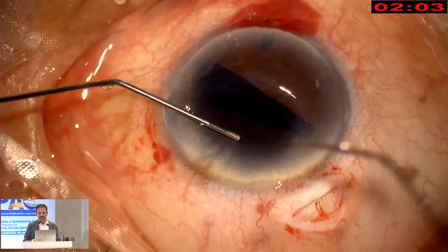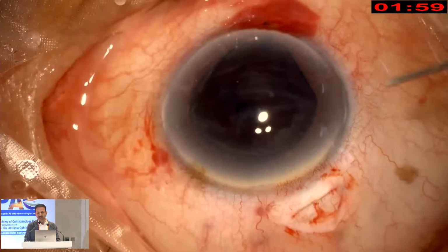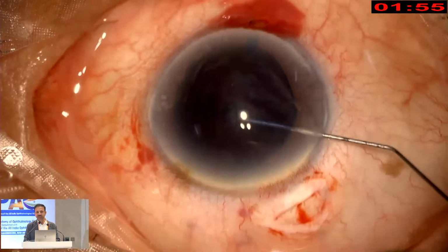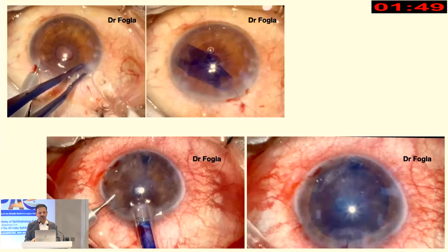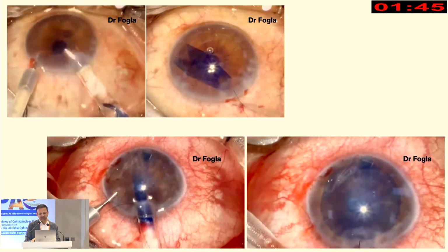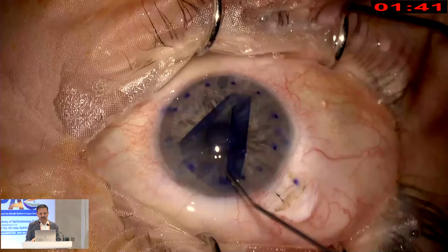Then you fixate this edge. You can tap on the inside or the outside, and you can get the scroll to open up, and put a small air bubble first and then enlarge it to complete the air fill. And this is very reproducible. I can show you various videos of how it works the same way. So this is like the go-to technique of insertion and unfolding that we do at this point of time.